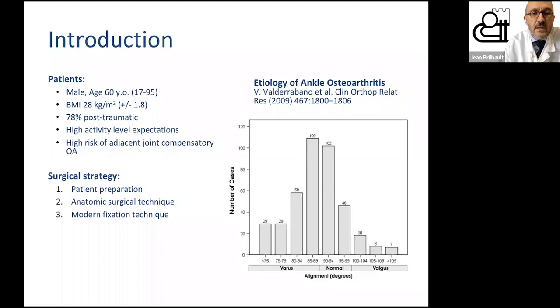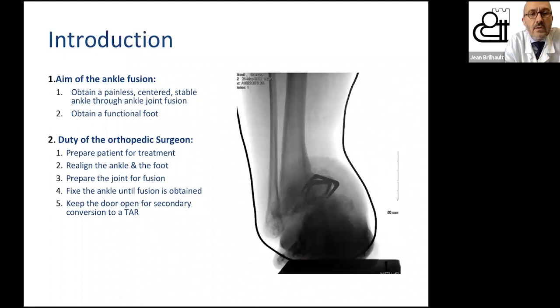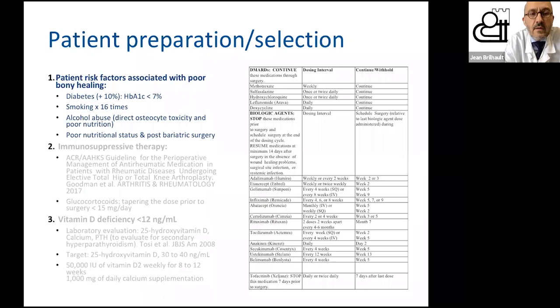So the aim of the ankle fusion is to obtain a painless, centered, stable ankle, or the fusion of the ankle joint, meaning that we want to obtain a functional foot. And our duty as orthopedic surgeons is to prepare the patient for treatment, to realign the ankle and the foot, both of them, to prepare the joint for fusion, and to fix the ankle until fusion is obtained, and keep a door open for a secondary conversion. So it's not the most fancy part of the treatment, but it is an important part as well.